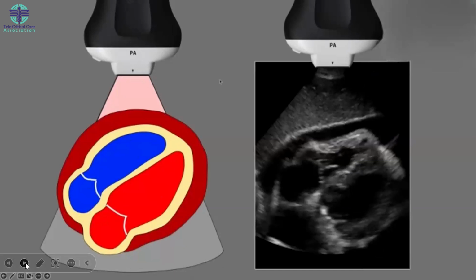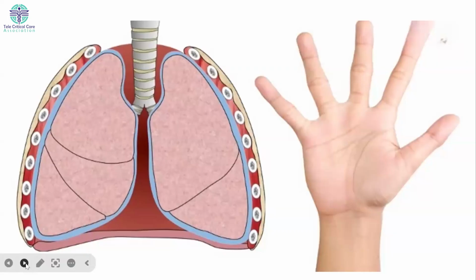hemopericardium. Now, even as little as 50 ml of fluid which gets accumulated in the pericardial cavity can cause cardiac tamponade, as opposed to chronic pericardial effusion, which can be as much as 200 to 300 ml of fluid, which will not be able to cause the cardiac tamponade. So acuity of accumulation of fluid is the most important parameter causing cardiac tamponade. Then that can be excluded using the subcostal view.